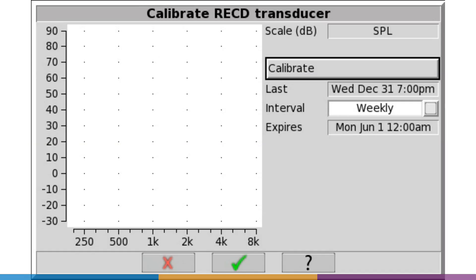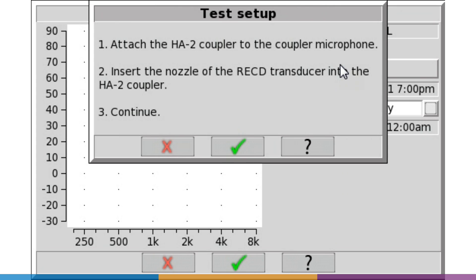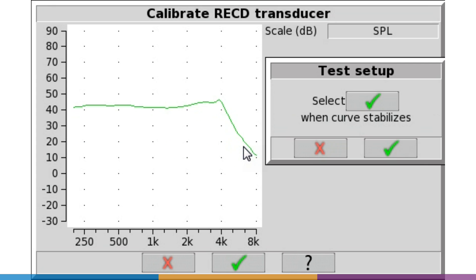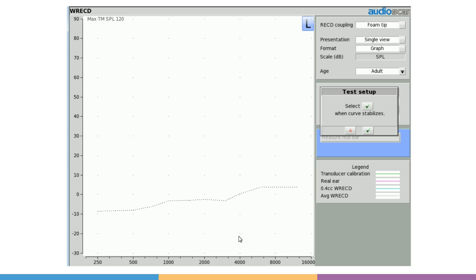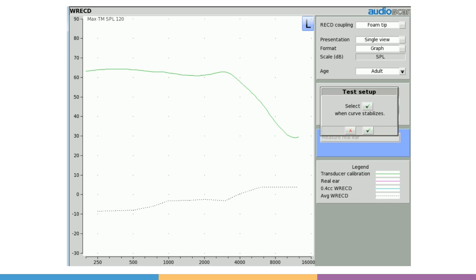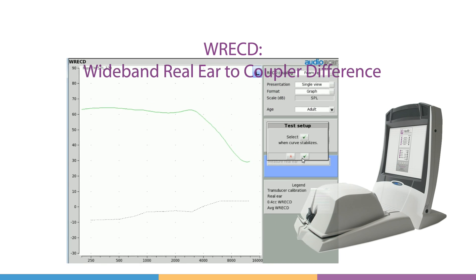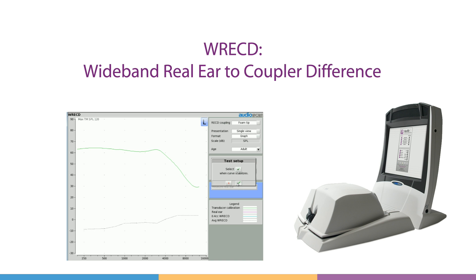Select Calibrate Transducer. Once stabilized, the green calibration curve is captured and stored. If it expires, you'll be prompted to re-measure. On the Verifit 2, the RECD must extend to 12.5 kHz to accommodate high frequency speech map, so it's been renamed WRECD, or Wideband RECD.